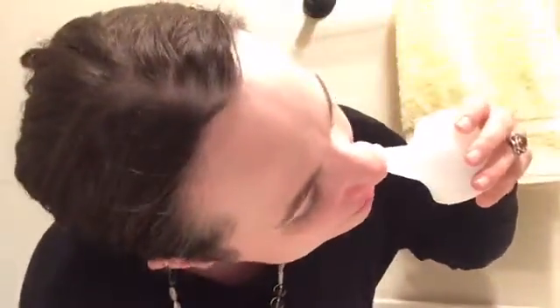And here we go. Key points to this are you want to make sure that your head is tilted forward so that there's a good flow of water from one side to the other. Sometimes when people do this, they accidentally tilt the head backwards, and as you can see, the water stops flowing and it starts going down the back of the throat, which is not a good thing.